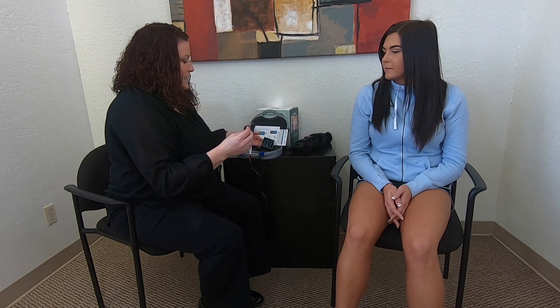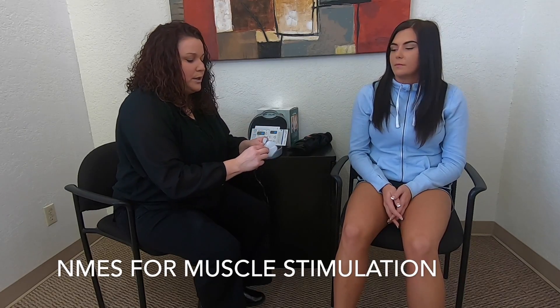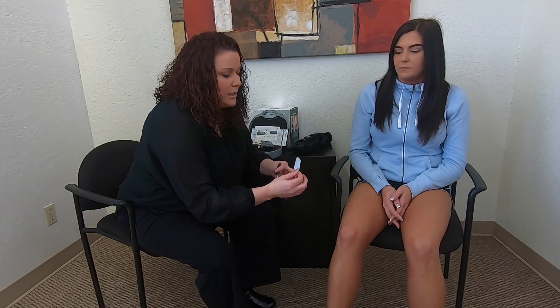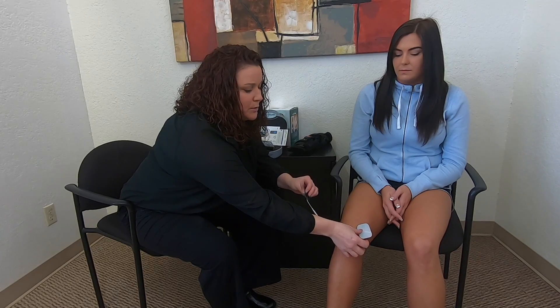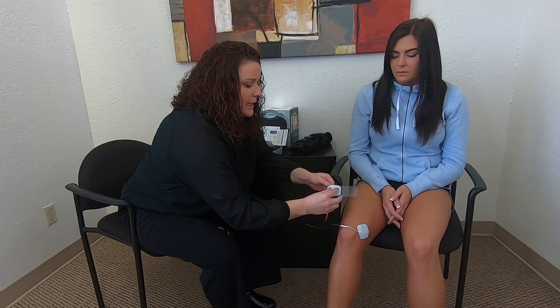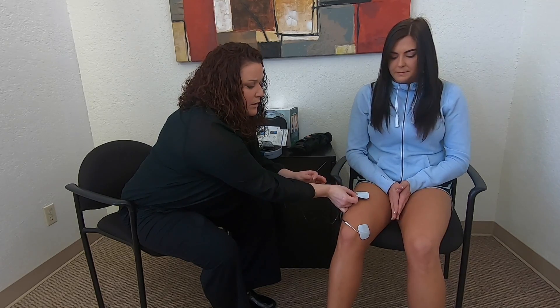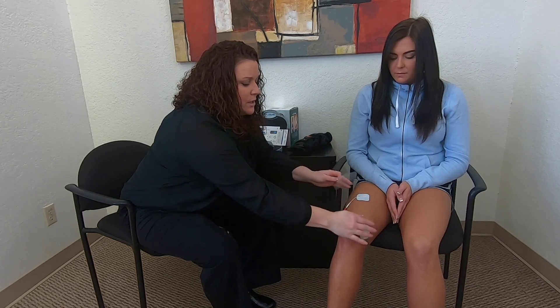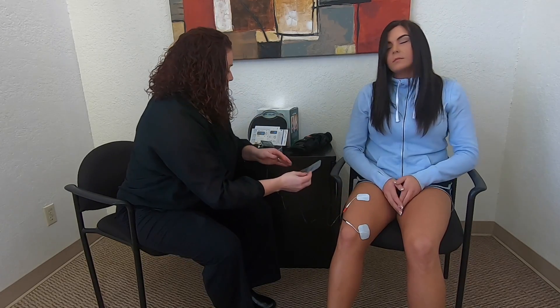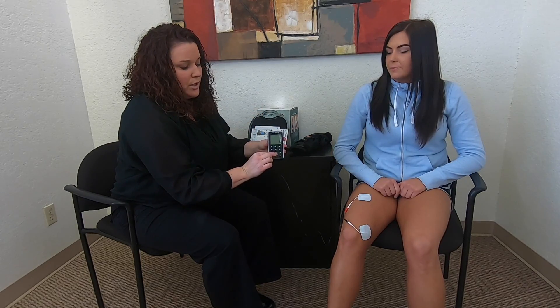Here's your device — please refer to the other videos for complete setup. For NMES, you're typically going to use just two electrodes. We're going to get a quad contraction, which is typically used post-surgically or post-injury to get the VMO to turn on again, which typically shuts off after injury or surgery. This is the standard pad placement for NMES for the knee.